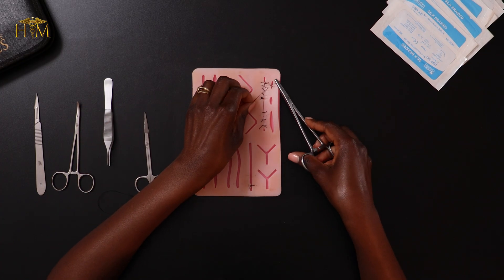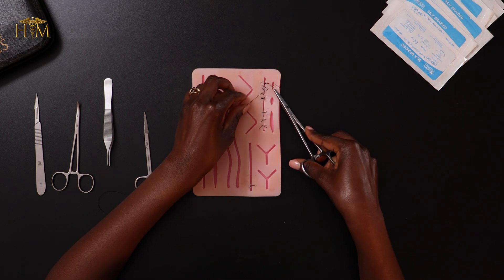Now you can already see the wound has come together quite nicely and you've got this sort of diagonal suture going across the wound. What I'm going to do now is tie the long suture to the short suture again in the opposite direction — so it's like you've got two diagonals basically crossing over in the middle.